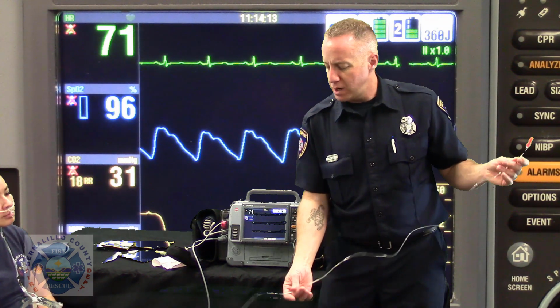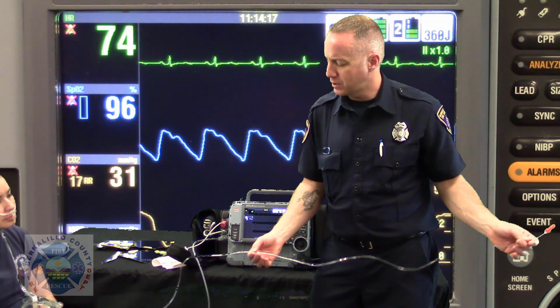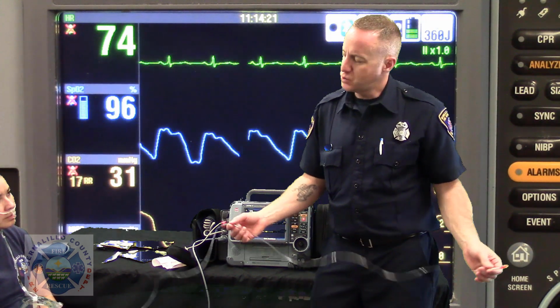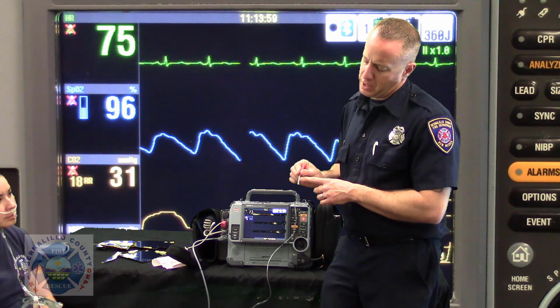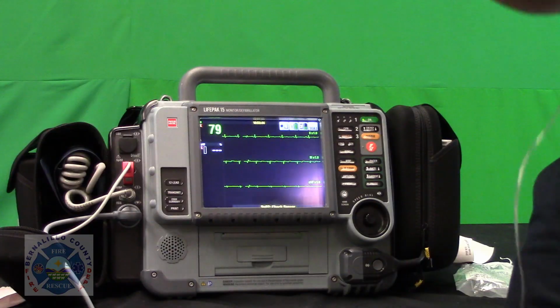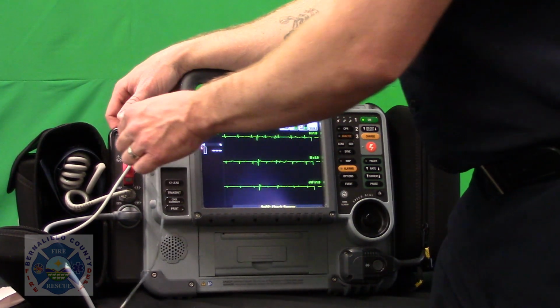So you're going to want to monitor that, and if you're dealing with blood or any kind of gross purulent secretions, I just say if it's getting about halfway through the tubing, swap them out with a new fresh cannula. You don't need to necessarily wait for the goo to get all the way to the filter before you change it out. So, things about the obvious and not so obvious about these devices.